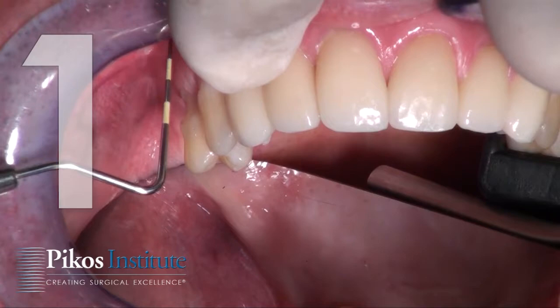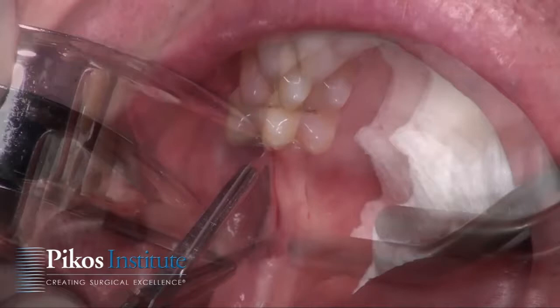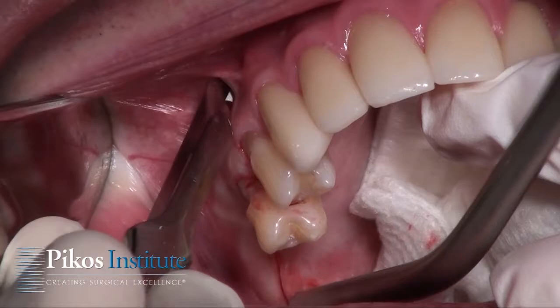This incision design will be mid-crestal and circumferential, starting at the base of the tuberosity and continuing anteriorly. There's our distal oblique release incision, and then anteriorly we include that papilla again — an oblique anterior release, all the way to bone.